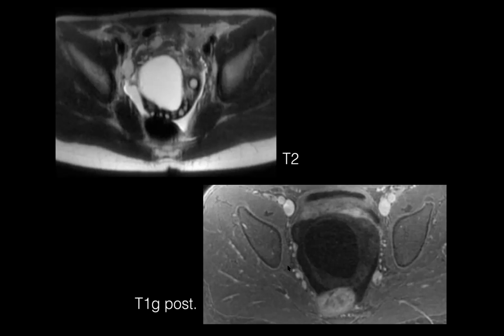And then this is a T1 weighted image that's done post-contrast. In this image, you can see again that ovary in the middle. And notice how these blood vessels are all bright from the contrast that's come on board, but this ovary is quite dark, right? So I wonder if anybody would want to hazard a guess as to what's going on with this child that has pelvic pain, and they've got this huge ovary that's swollen and not really enhancing here.